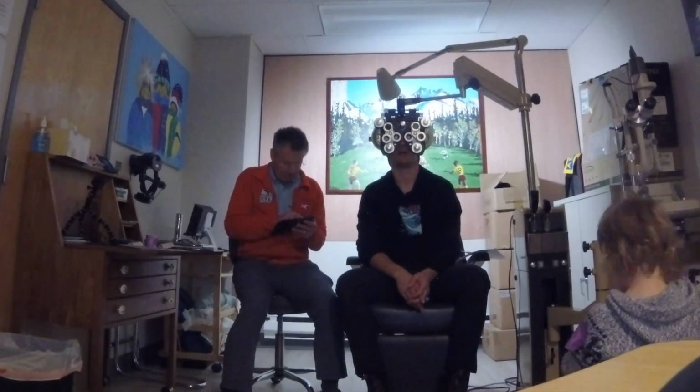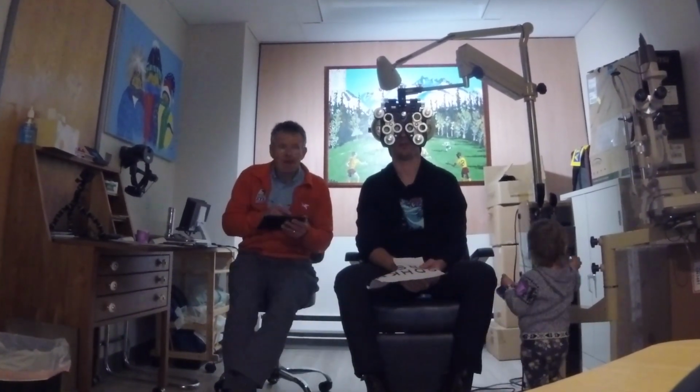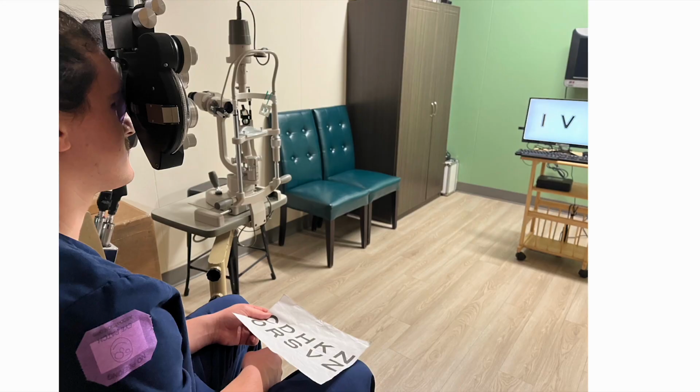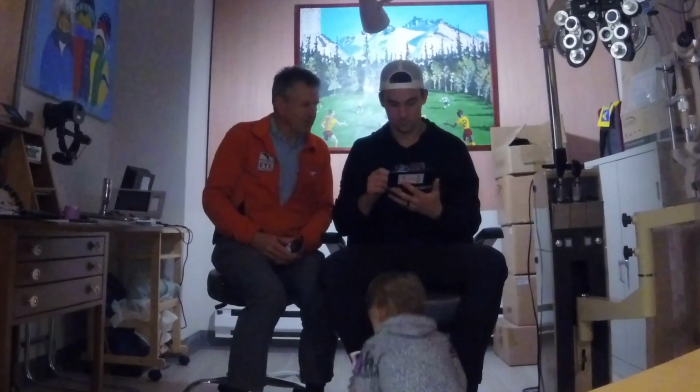The electronic eTDRS system probably is the most precise visual acuity testing, but it takes almost 6 minutes to do both eyes. With eTDRS, we used Sloan letters and used a matching card and patched the non-tested eye with best corrected visual acuity. We also used best acuity on PDI Check near testing. Since most of the amblyopic patients suppress their vision, PDI Check's rivalry did not match eTDRS.